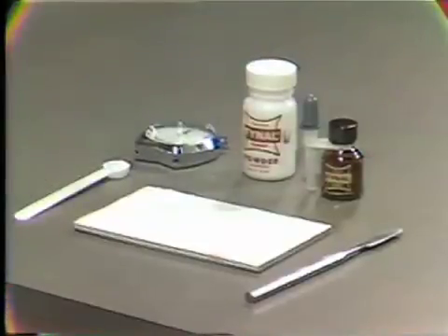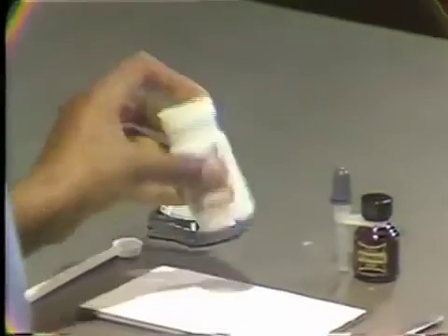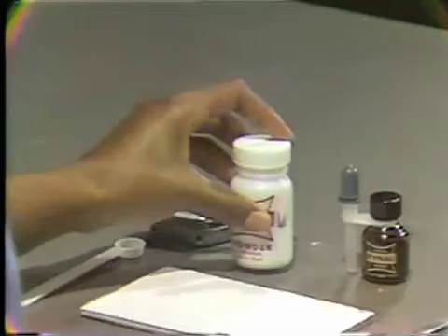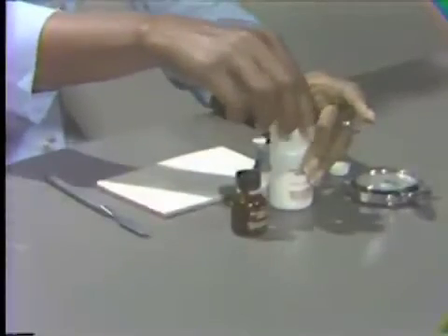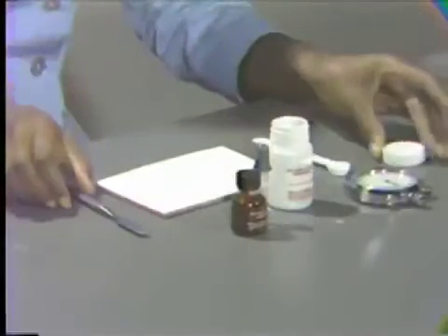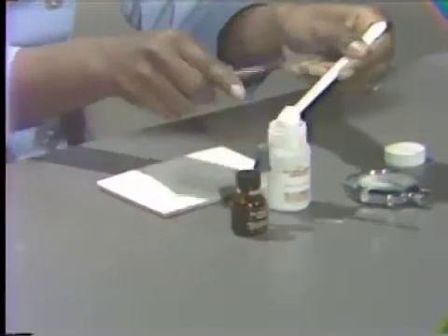In dispensing the materials, the dental assistant begins by rolling the bottle of powder to separate the particles. One level scoop of powder is measured onto the right side of the mixing pad.